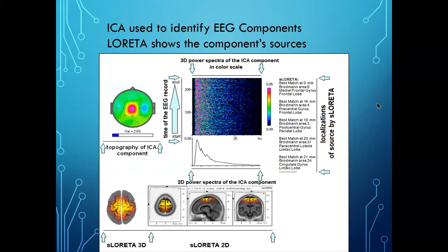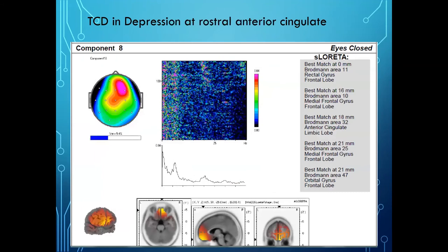When you do it for an EEG, you can find components that are meaningful components. We're not taking artifacts out with ICA. Again, my simplistic idea of what it could be used for, when I handed the idea to Yuri by giving him the paper, I thought of it as a de-artifacting technique. But it can be used to find meaningful components like this component.